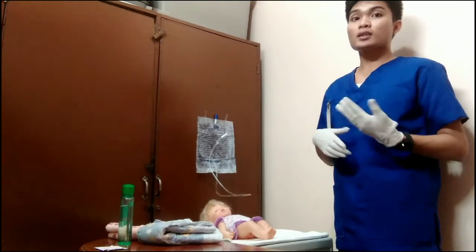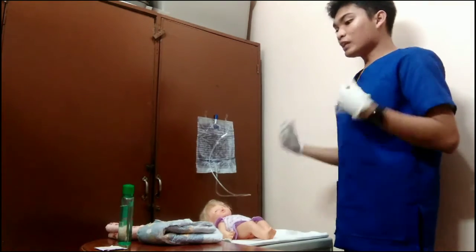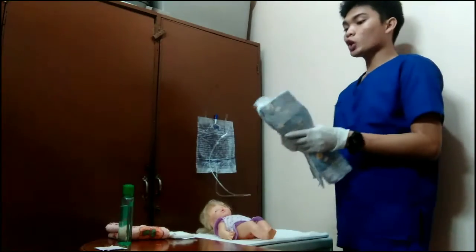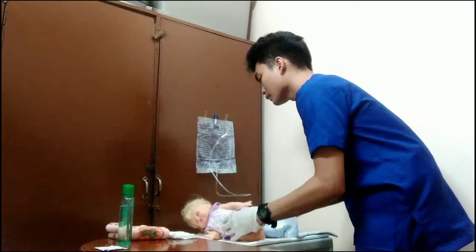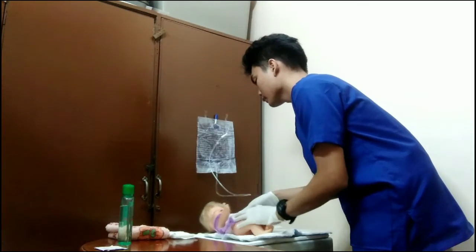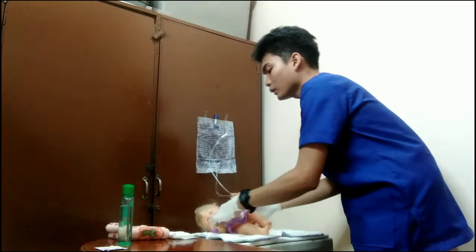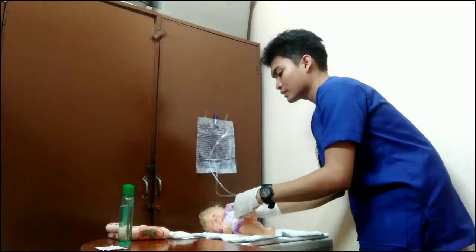But first we will be putting a linen under the client, an absorbent linen under the client. And then we will be assisting the client in a left lateral position with her knees actively flexed.